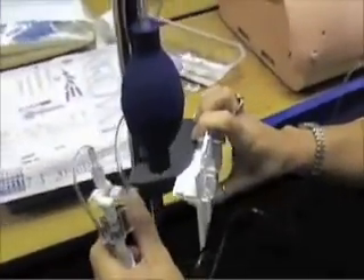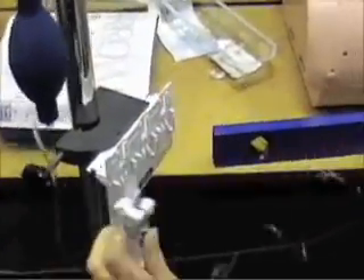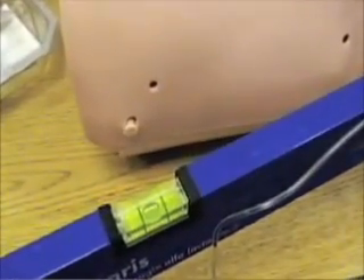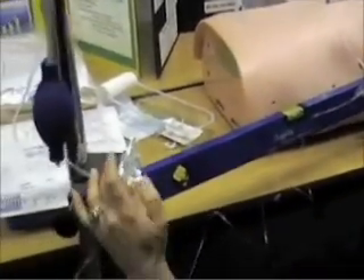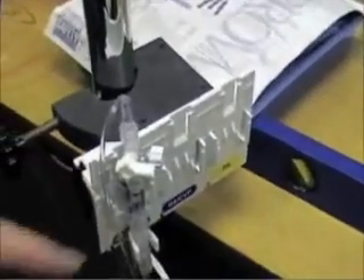Instead of connecting this to a pole mount, you can tape it directly to the patient's body, as long as you're still at the phlebostatic axis. You're looking for the bubble in the middle. Once that's done, you place the transducer in these holders, or on the patient's body.